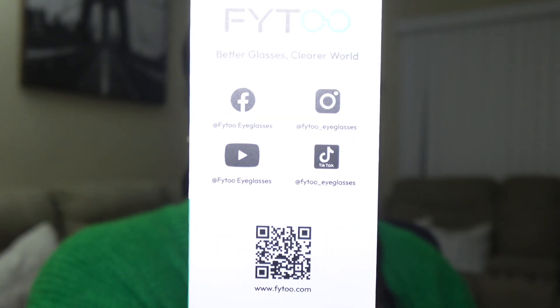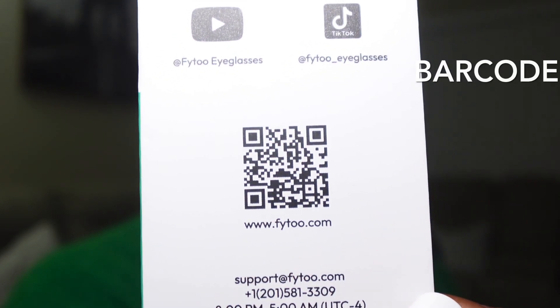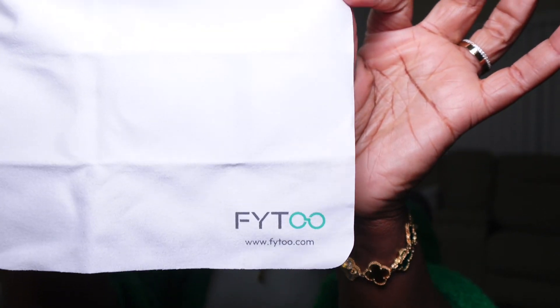Inside the box I received a ruler — I think this is for you to measure your face to make sure you get the right sizing for your glasses. Also in the box I received a booklet with information about the brand. They are on Facebook, Instagram, YouTube, and TikTok, so you can scan the QR code. Also in the box there's a bag with a little screw to tighten or loosen the glasses.